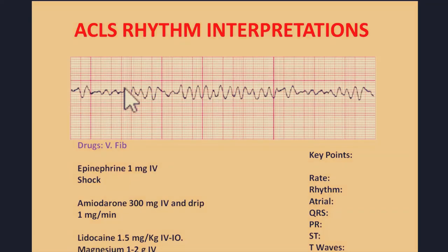Here's another example of a fine ventricular fibrillation with more visible QRS complexes, but nonetheless the prognosis in these patients is very poor, and immediate treatment is of the essence in establishing a stable cardiac rhythm.